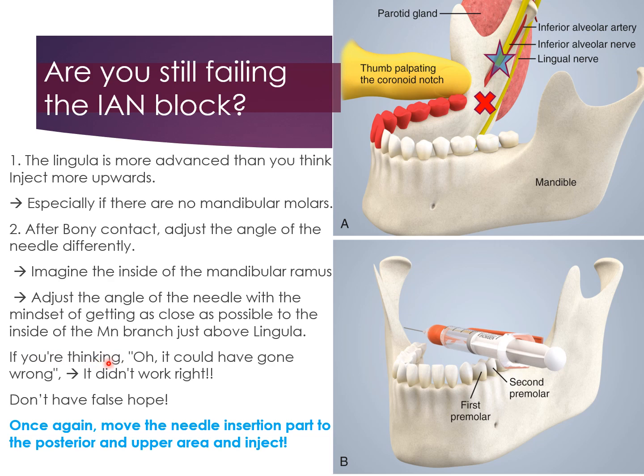If you're thinking, oh, it could have gone wrong, it did not work right. Don't have false hope. Once again, move the needle insertion point posterior and upward and inject.